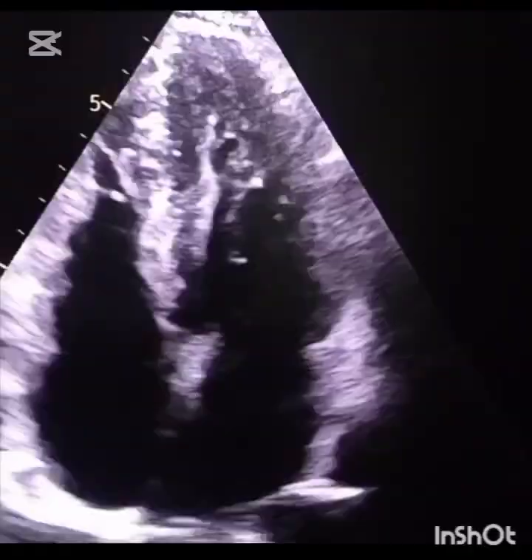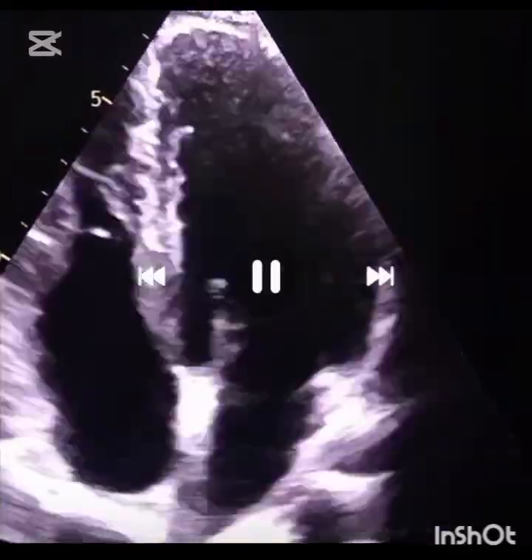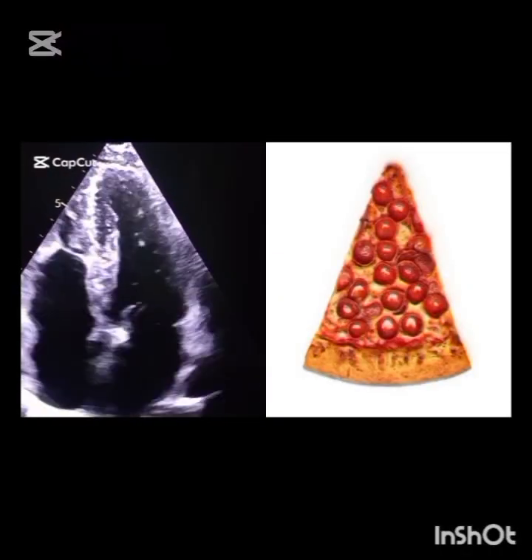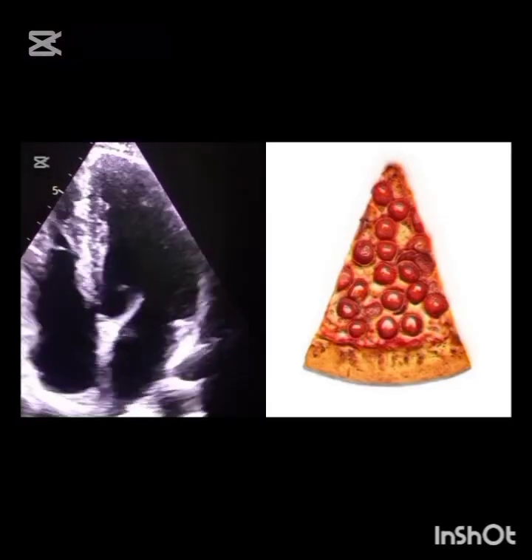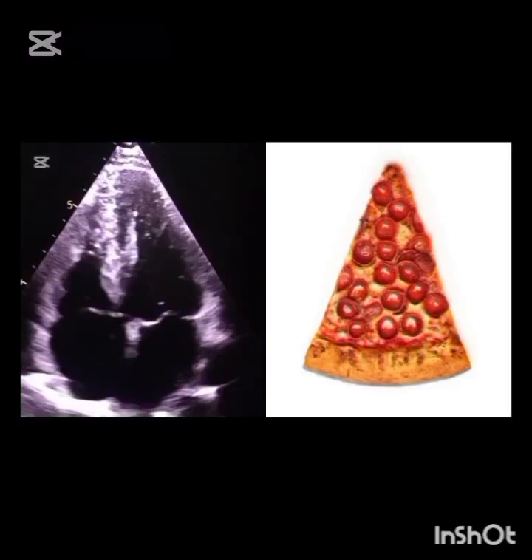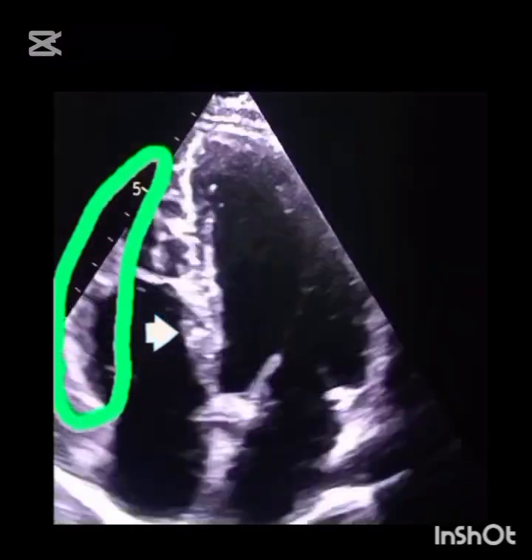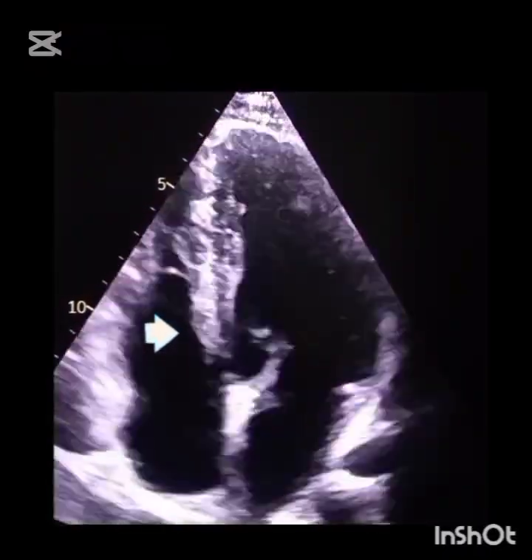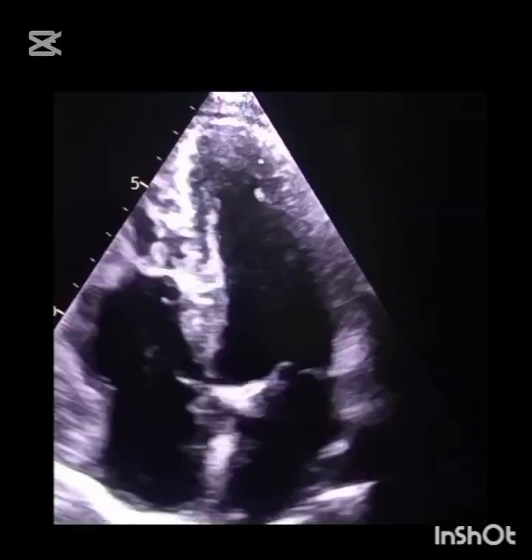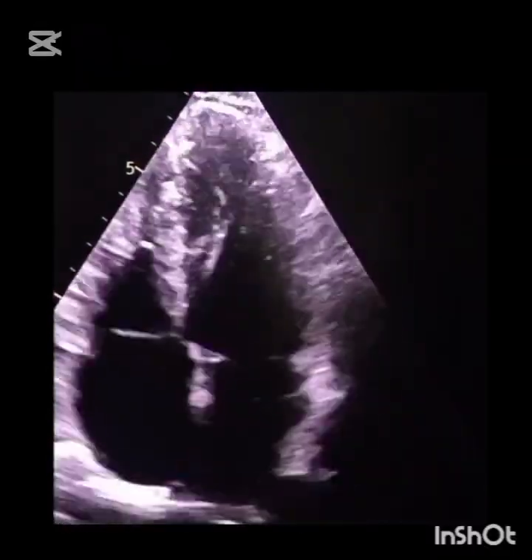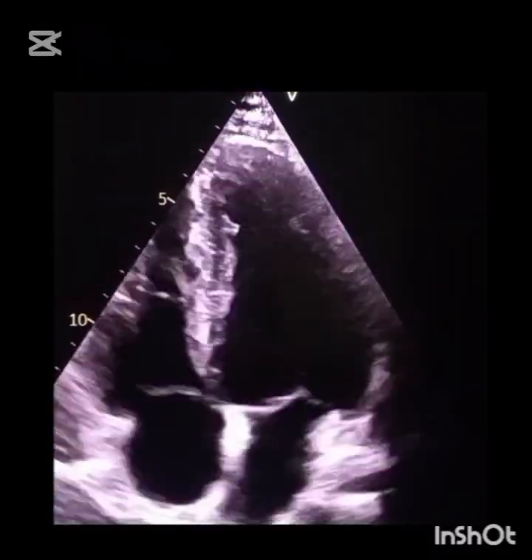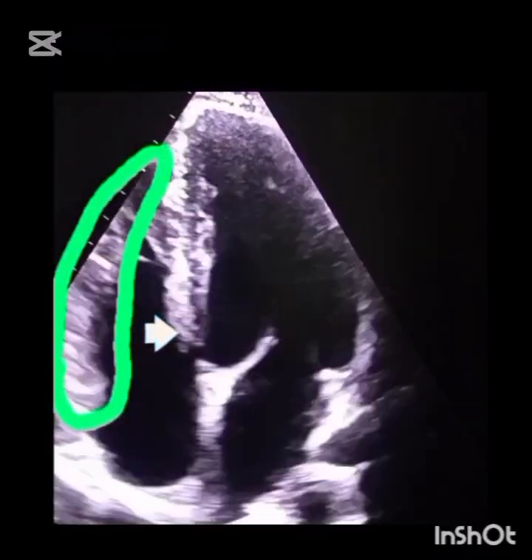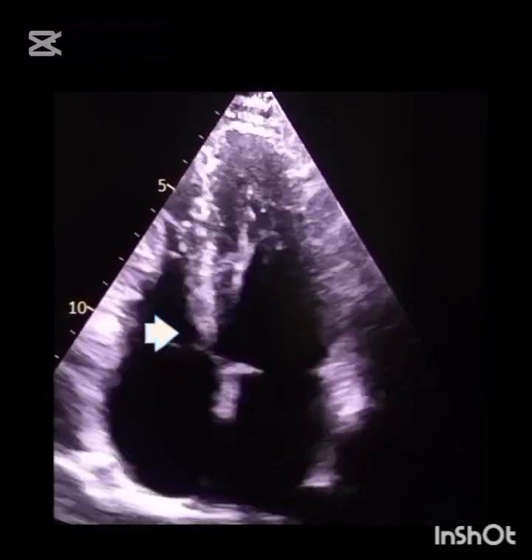We have some challenges of RV assessment. The right ventricle size and shape should be triangular, like a pizza slice as seen here. The tricuspid annulus should move upward toward the apex during systole and move back down during diastole. The free wall of the RV should contract toward the ventricular septum during systole and move away from the septum during diastole.